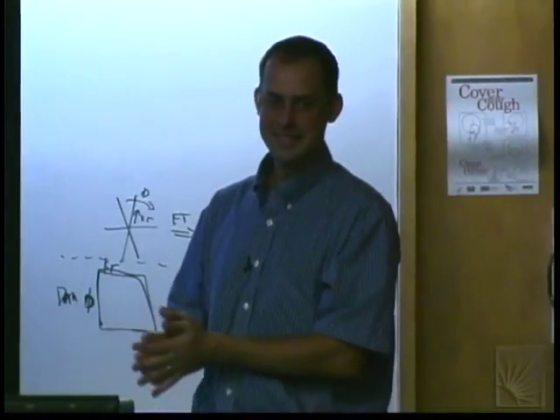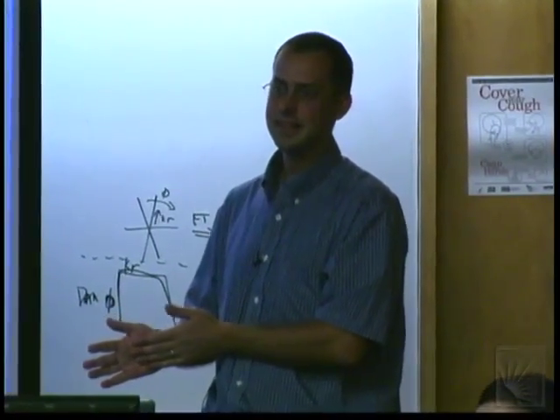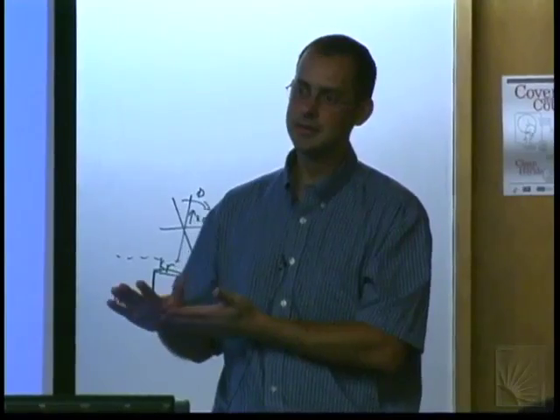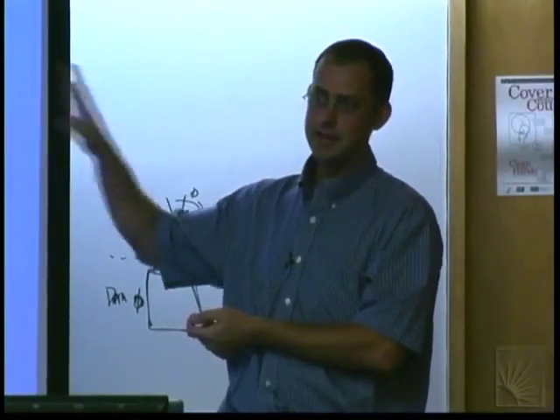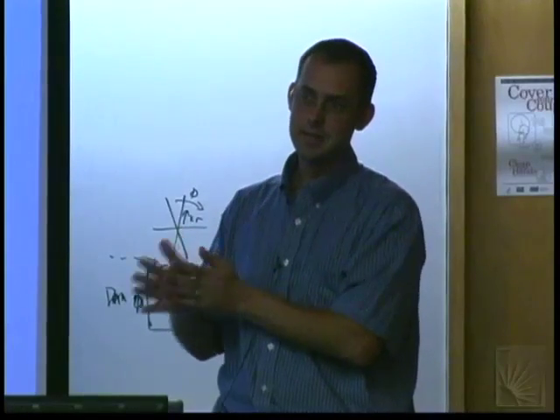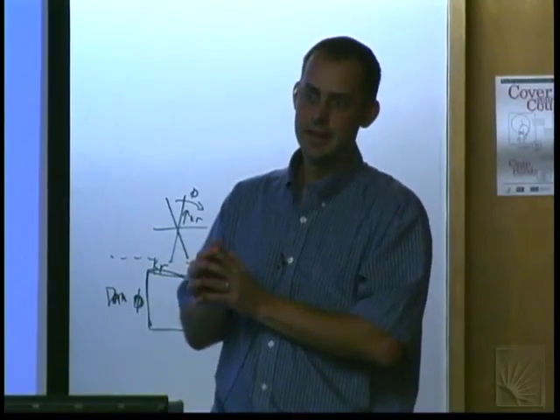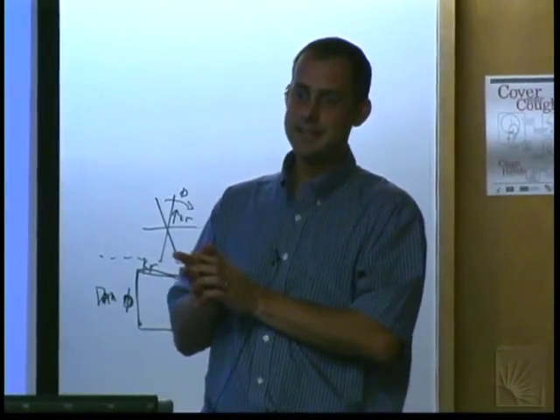It's not simple. So these multi-kilowatt RF amps, are they on the whole time the patient's there, or is there a duty cycle? They could be on as much as 50% duty cycle. If you go into a magnet today, I can put your whole body right at the FDA limit for heating. Will it warm you up? Oh yeah. You can feel it? Oh yeah, it's nice in winter.